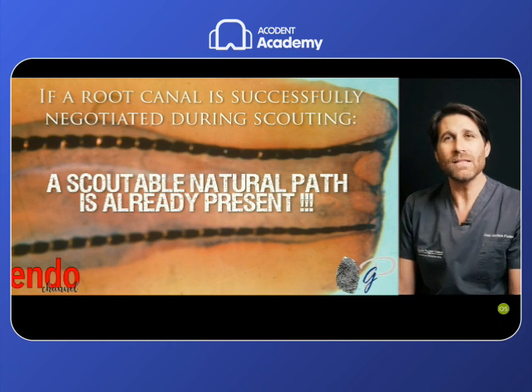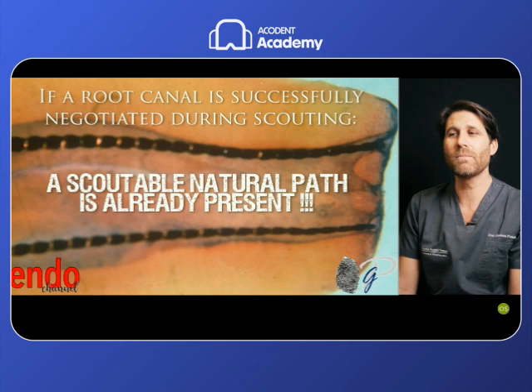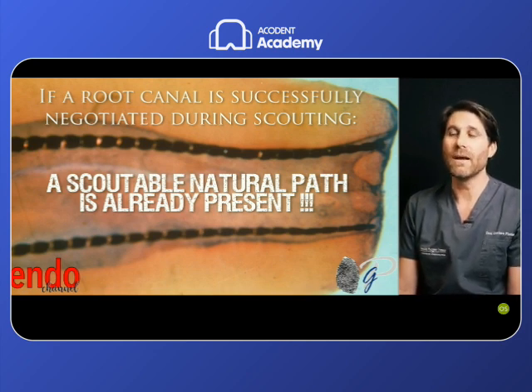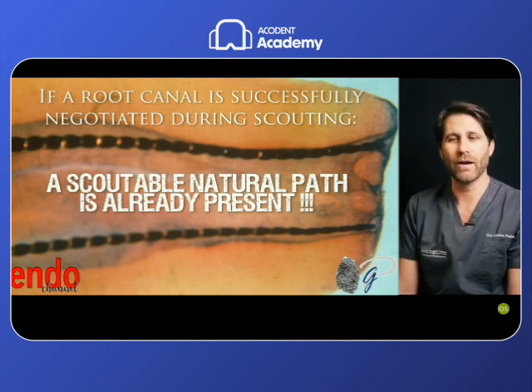So this space is always present in nature. The problem is if we are able to successfully scout and negotiate this space. So if this natural path is scoutable since the beginning, it means that a natural glide path is already present inside these root canals. That is this more or less 85% of the root canals that we can encounter.